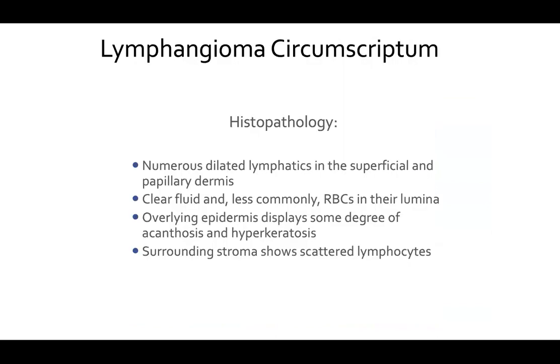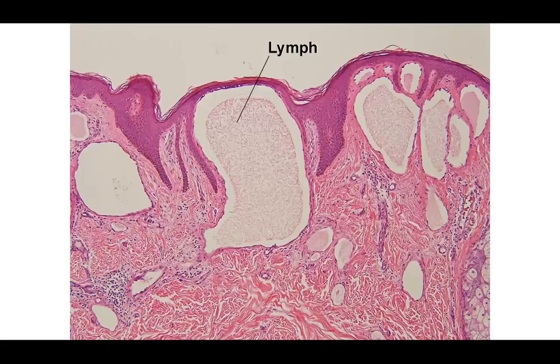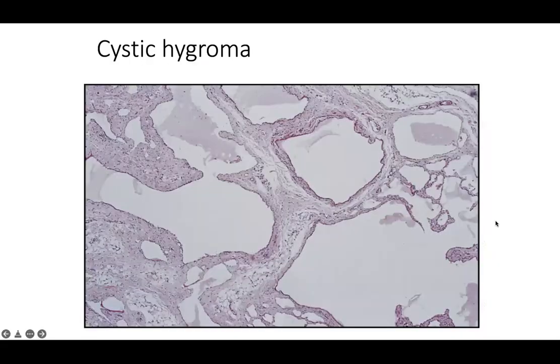On histopathology, lymphangioma circumscriptum shows numerous dilated lymphatics in the superficial and papillary dermis filled with clear lymphatic fluid but can have red blood cells in their lumina. The overlying epidermis shows acanthosis and hyperkeratosis, and the surrounding stroma shows scattered lymphocytes. Here you see a dilated thin-walled vessel mostly filled with lymph fluid, in contrast to a thin-walled capillary filled with red blood cells. Cystic hygroma is a deeper-seated lesion — a deep malformation of thin-walled endothelial cells. You would confirm lymphatic nature with D2-40 podoplanin staining.